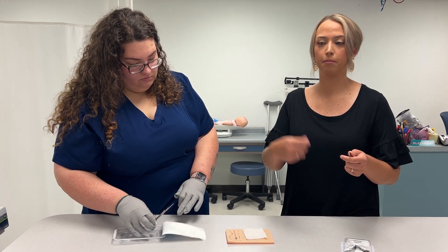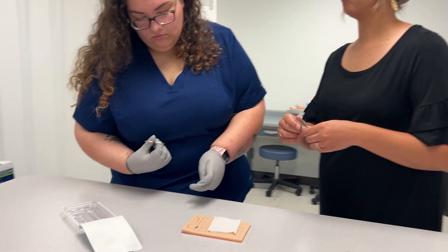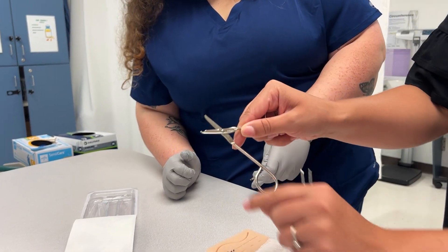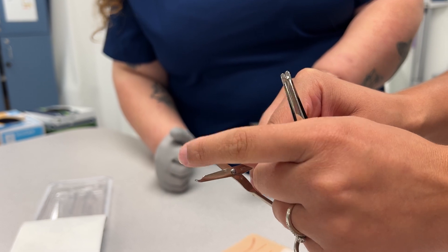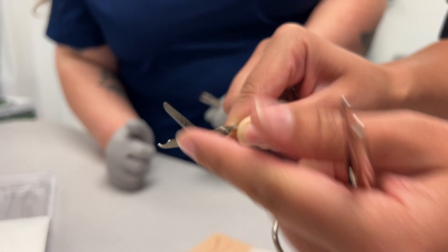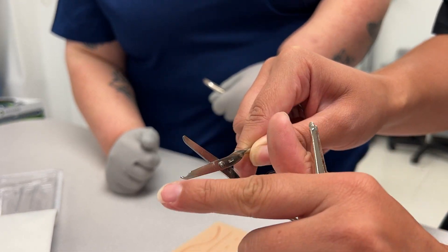We'll use the gauze just to count and make sure that the same amount of stitches that we put in come back out of the patient. On these scissors, they have a little loop underneath — as you can see, this is to get up underneath the stitch to make the cut a lot easier. This is also a blunted tip scissor end, so we're not going to cut the patient. This part is sharp, but neither of the tip ends are sharp.